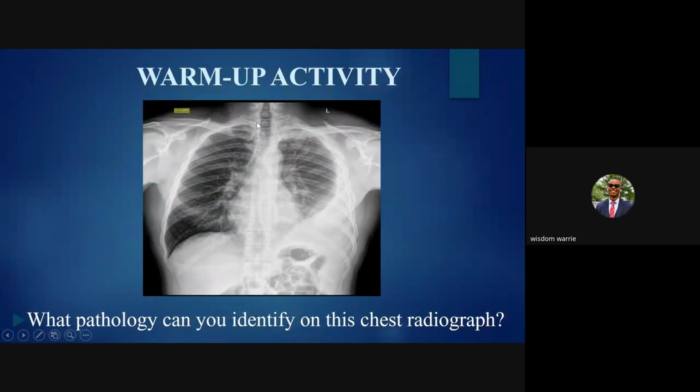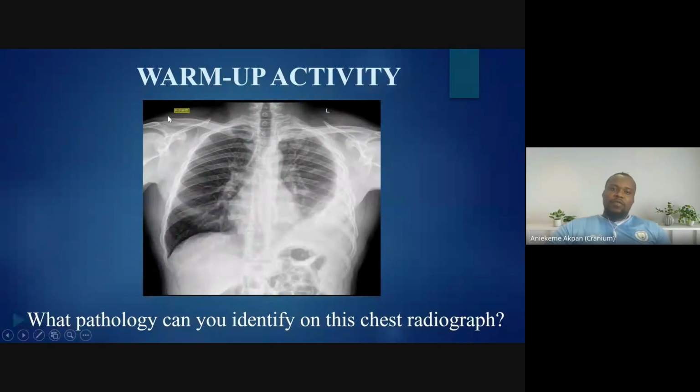All right. So let's just quickly look at this because of course you guys did this yesterday. If you look at the image, you were taught how to pattern recognize a chest radiograph, how to evaluate a chest radiograph. And they also taught you how to assess the quality of a radiograph. And to evaluate a radiograph, you are using the A, B, C, D, E. Some can even add F. F there is for foreign body.